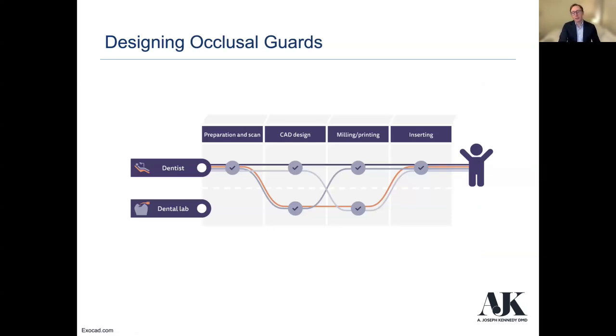Again, there's so many different types of design platforms out there. Many of them come with the printer, but if you really want to get into CAD design, the top one I would say is ExoCAD, although it's quite expensive. But you see other companies like Planmeca, they've got their own design suite. You've got Trios and 3Shape has their own design suite. So you've seen a lot more of that coming out there. BlueSkyBio is another one that's free where you can do some CAD design.